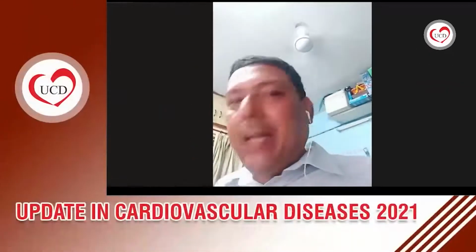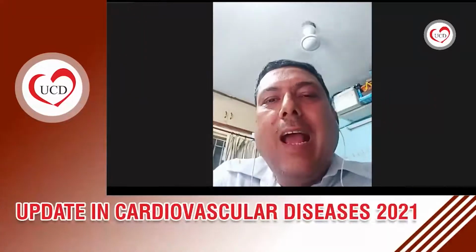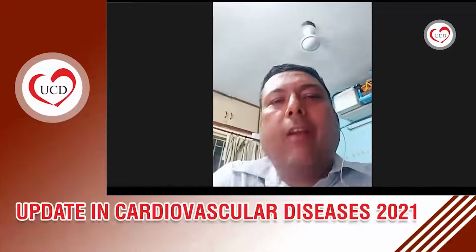Dr. Narsimha, this is a very common query that we find: an RBBB with a PR interval of 180 milliseconds. And these patients are often refused for any general surgery. In the pre-anesthetic checkup, the anesthetist will say it is high risk, get a Holter done. Some say put a temporary pacemaker while doing surgery. And the patient is entirely asymptomatic. So what is your take-home message for these type of patients? Because it's a very common scenario.